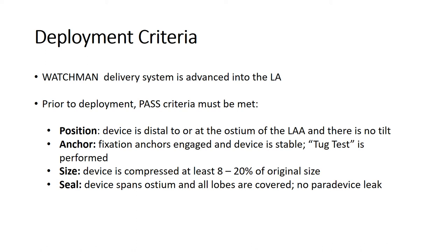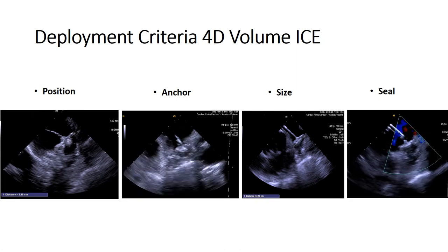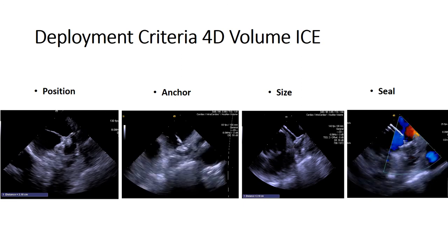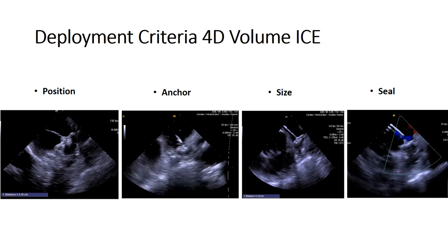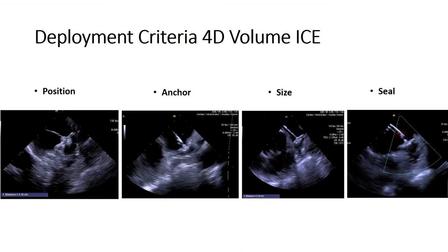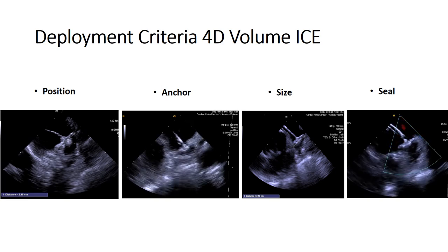Following deployment, the PASS criteria must be met as under TEE guidance. PASS stands for position, anchor, size, and seal. The first step in the deployment assessment protocol is to perform a 2D analysis of the Watchman device using the PASS criteria — position, anchor, size, and seal — utilizing the 2D functionality to completely assess the PASS criteria post Watchman deployment.